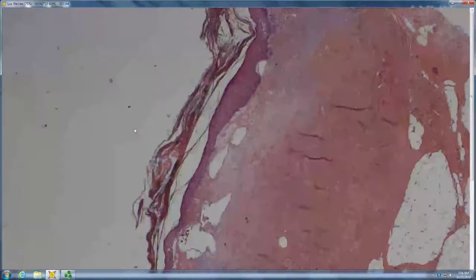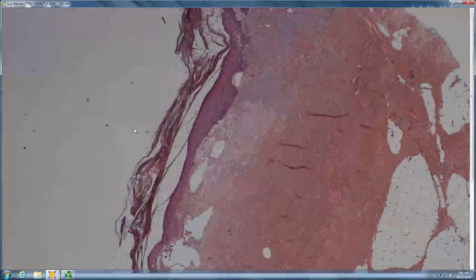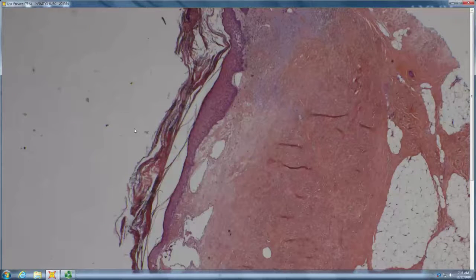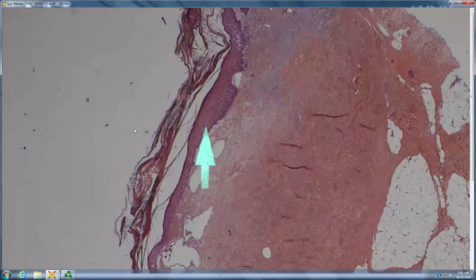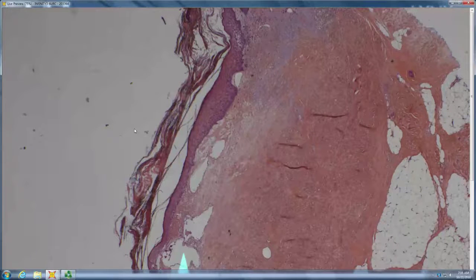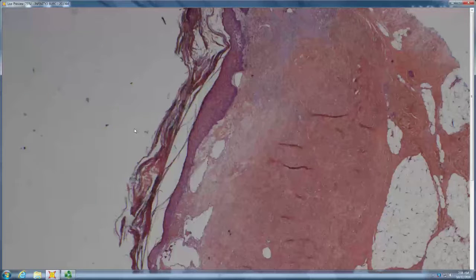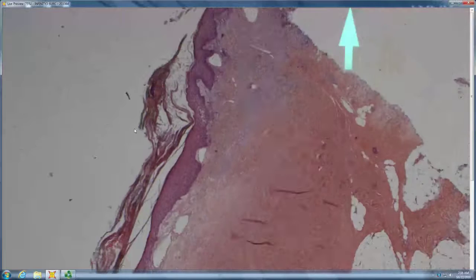Sure. So let's do a little bit of hyperkeratosis. You've got hyperkeratosis. The epidermis looks effaced. There are some ectatic vessels there. Is it entirely effaced, or are there areas of acanthosis as well? They're kind of both, right? Yes, sir. And then there's that elastosis. You commented on the ectasia and elastosis. Is there anything curious about the elastosis? It's a little bit bluer.